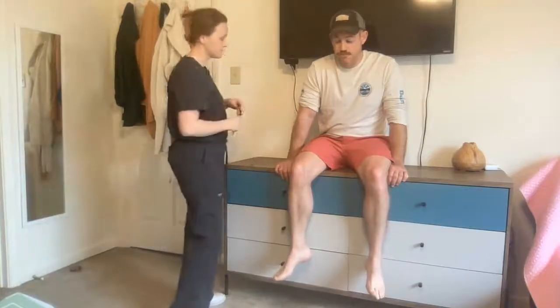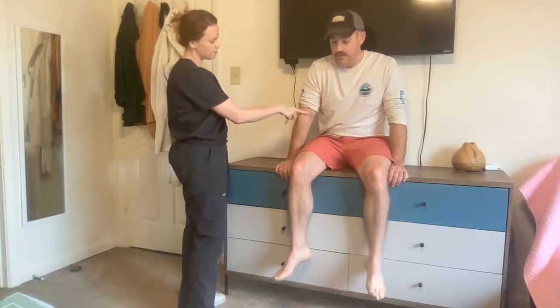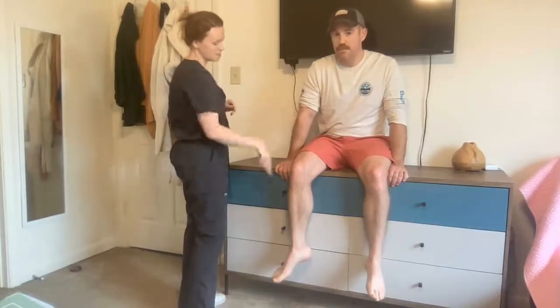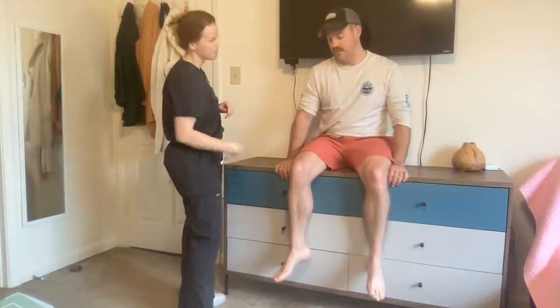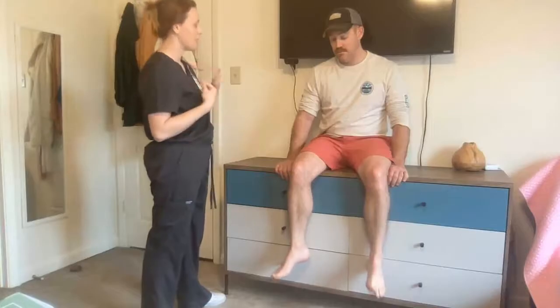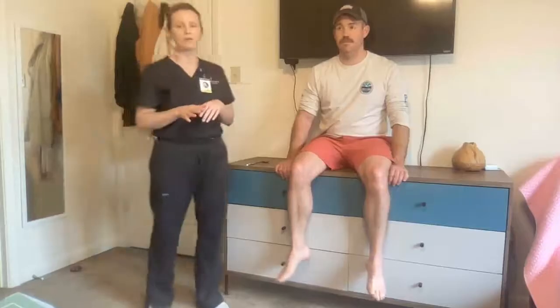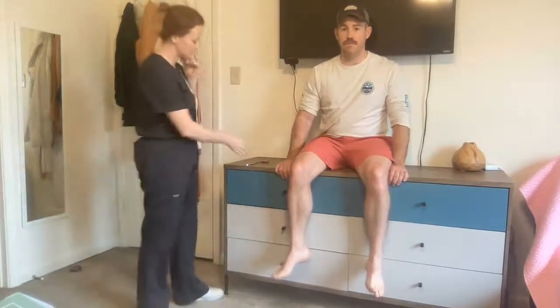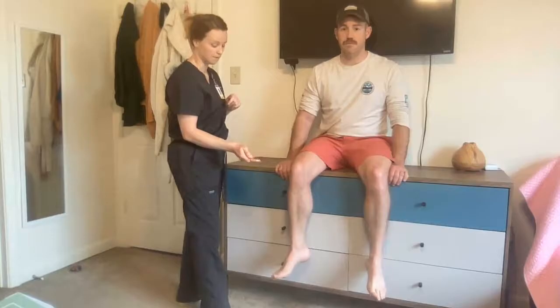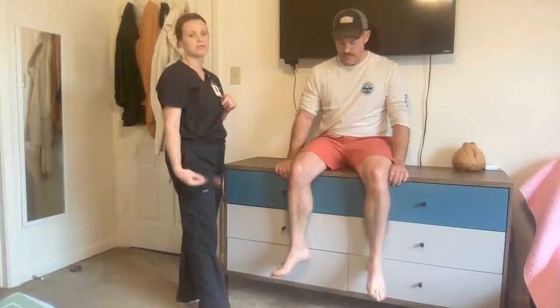For the deep tendon reflex assessment, I'm going to use this hammer here. I'm going to tap gently on four different areas of your body: your bicep tendon, your tricep tendon, your patella tendon, and your Achilles tendon. What that does is it elicits a stimulation response, and we assess that response. Now, this procedure can be done on any individual, but it is important to do so on pregnant patients as it indicates pregnancy-related complications such as preeclampsia. For example, if I was to tap on a pregnant patient's patella tendon and it was hyperreflexia, that, along with other signs and symptoms, would indicate preeclampsia.